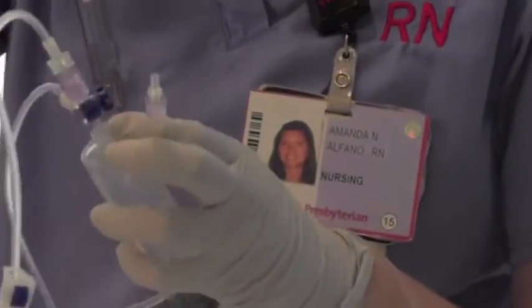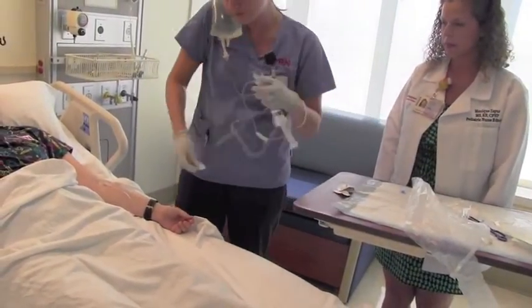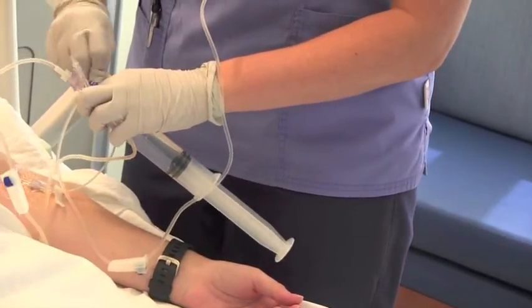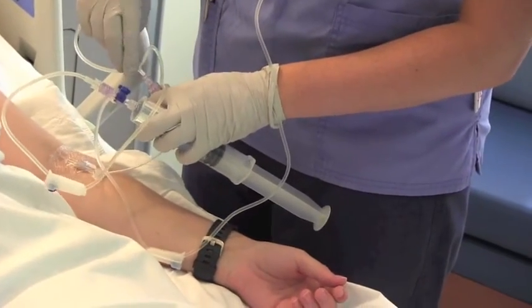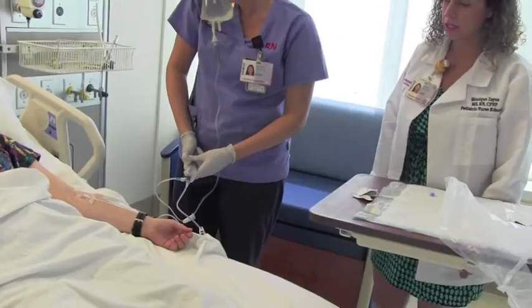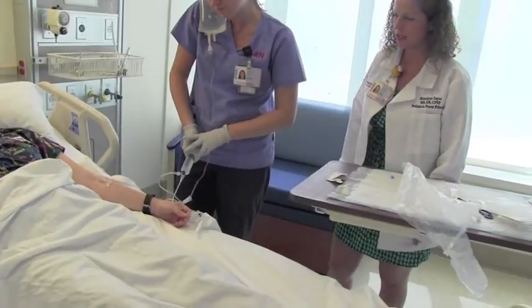Okay. So we're going to scrub the patient's IV site for 15 seconds, and then attach the push-pull. And then you'll turn the stopcock off to the fluid and open to the patient's IV. So yep, it's open. And so you're just going to push the fluid into the patient's IV.